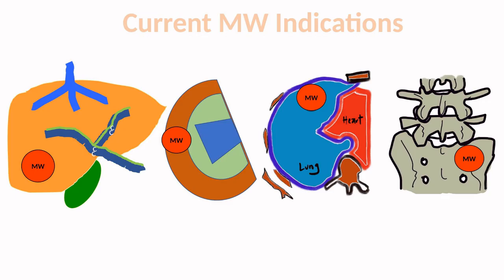These are the most frequent indications for microwave. Primary liver tumors or metastasis, kidney tumors, lung tumors and bone tumors. And even thyroid nodules and breast tumors.